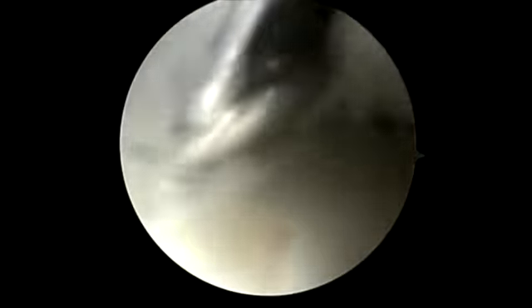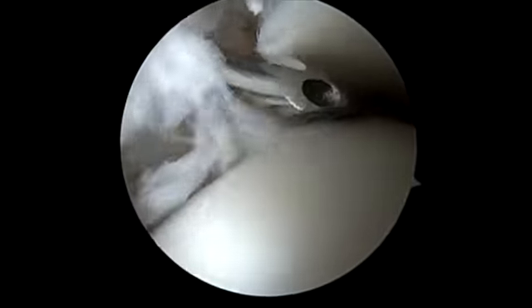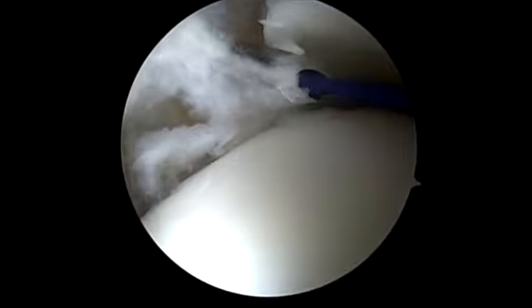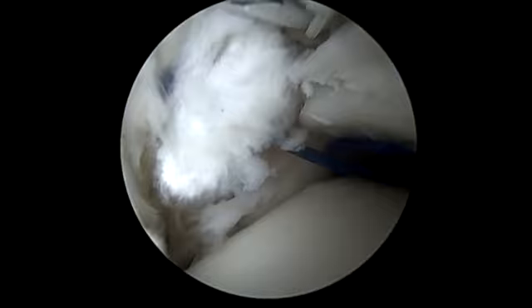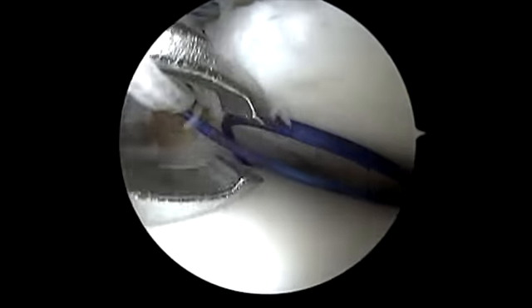A Spectrum suture passer loaded with PDS suture is introduced through the anterolateral portal and is used to pass thread from the suture anchor implant via lasso loop technique. It is performed 2 times. Single suture might be used as well.